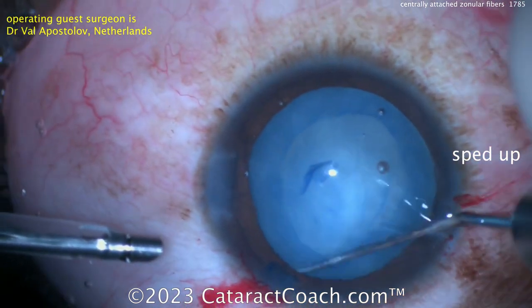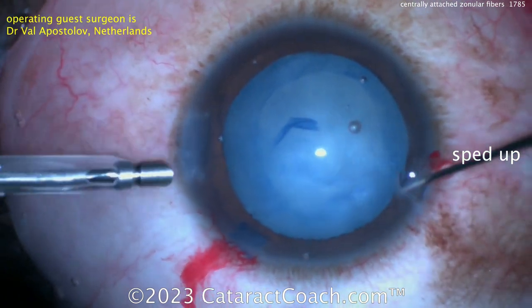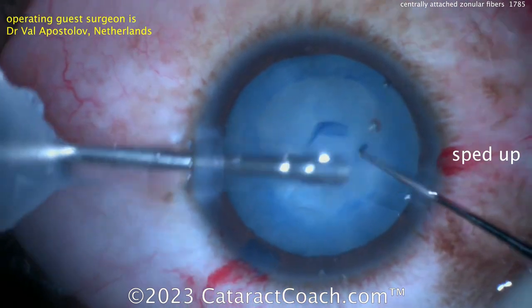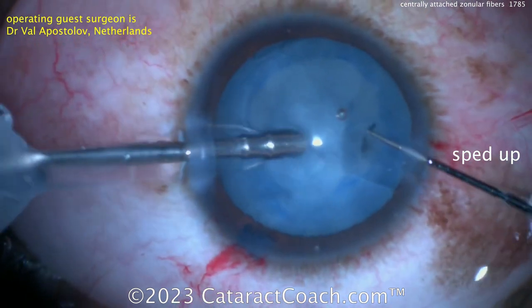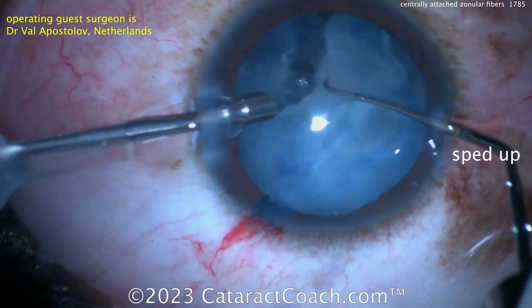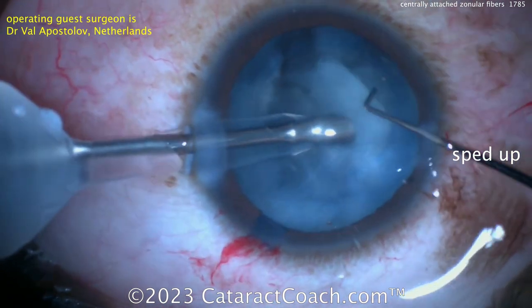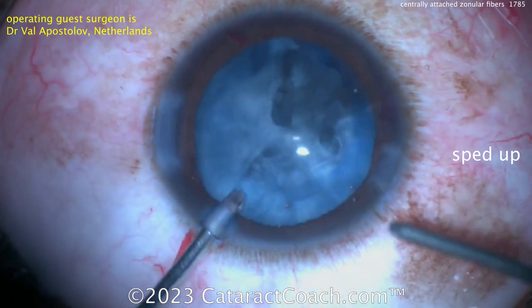Now the chopper is going in to do hydrodissection — a manual dissection there with the chopper. The phaco probe going inside here, chopper going in as well. The surgeon is sitting superiorly but operating temporally, just vacuuming this out. There's not a lot of density here, so it's pretty easy. There's some HPMC to coat the cornea. For a nucleus like this, just kind of lifting it up — mostly vacuum, almost no ultrasonic energy is really needed here. This is probably a younger patient with very little nuclear sclerosis, mostly just whitening of the cortex.